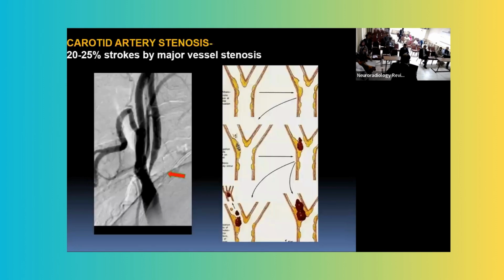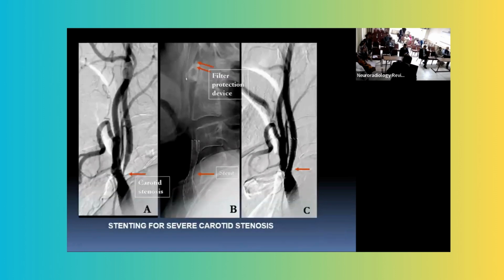We can also deal with the treatment of stenosis at the origin of the internal carotid artery, due to atheromatous plaques leading to TIAs and stroke. So both carotid endarterectomy and carotid artery stenting are effective management tools. Regarding stent placement, we can place a stent without any protection device, or we can place a filter or a proximal balloon. Still, the trials show that the results are similar with and without protection devices.